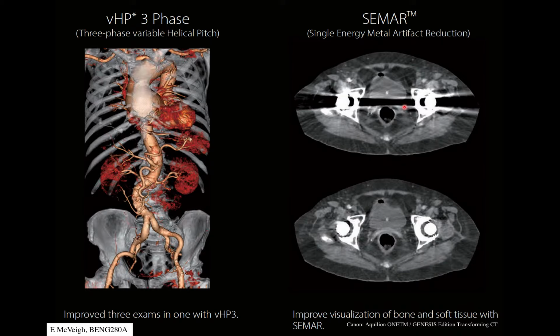There are interesting artifacts in CT which people are still combating. For example, if you're imaging through a patient's hips and they have artificial hips, which are metallic objects, they attenuate X-rays very highly. And so in the views that are taken through here, it looks like there is nothing inside here, because you just can't see in there, right? And so the reconstruction is full of this metal artifact, but smart modern techniques for image reconstruction that use modeling can get rid of that artifact.